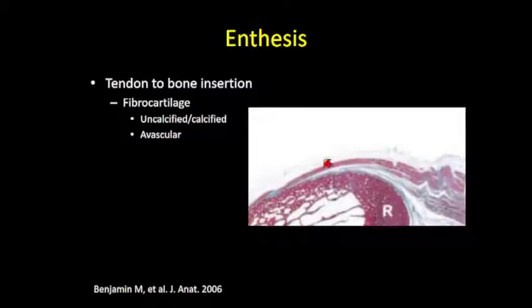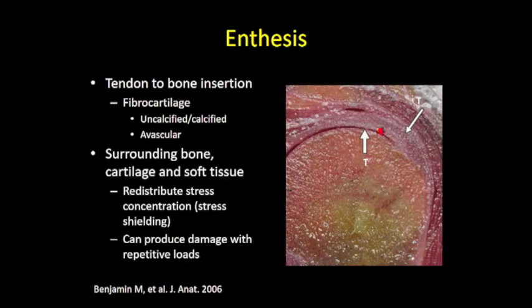The second important thing to recognize is that most of the tendon tears that we're going to see really occur near the sites where tendons insert on bone. And tendons insert on bone through a fibrocartilaginous avascular zone going onto the bone surface. And typically, we see these tendons insert onto bone next to a very convex surface, usually consisting of bone or articular cartilage or soft tissue.